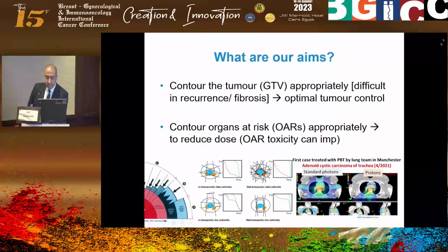And I give you an example here of the first case of protons which we treated and I was privileged to be part of in Manchester. So this is an adenoid cystic carcinoma of the trachea in a young female.